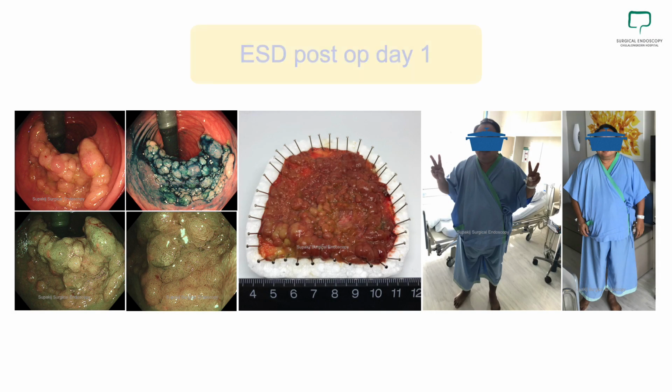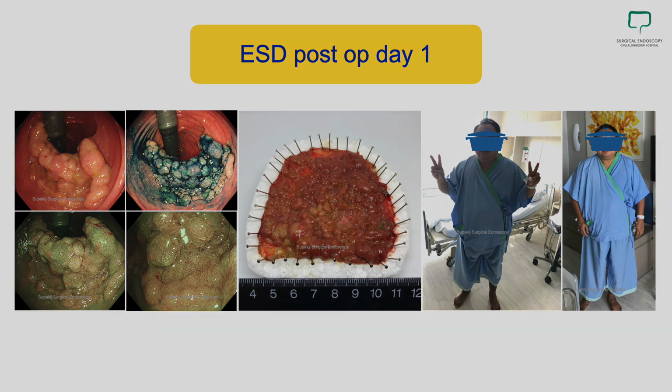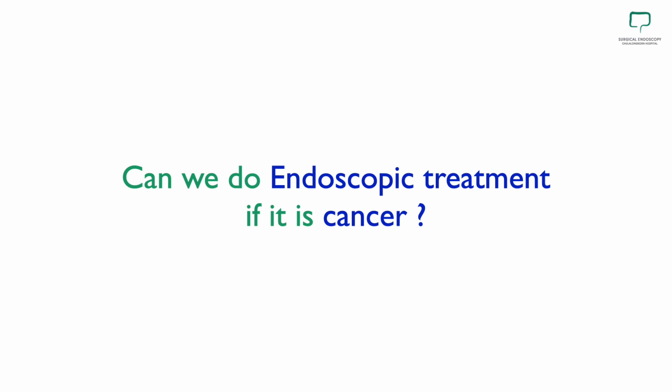Compared to endoscopic resection, this patient underwent ESD for an ascending colon lesion, and this is postoperative day 1. He can enjoy walking around the hospital and go back home in a few days. Endoscopy is better for the patient compared to surgery. So the question is, can we do endoscopic treatment for malignant lesions?